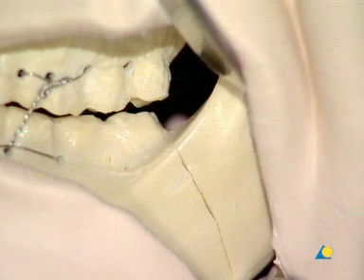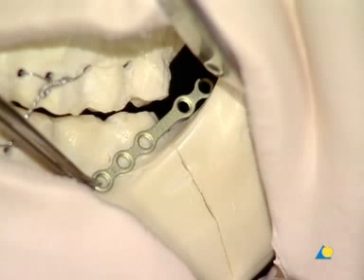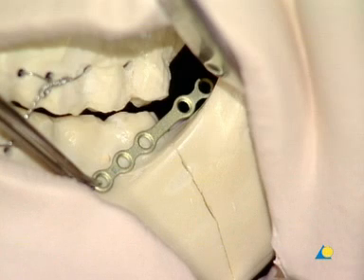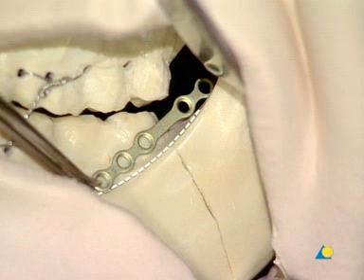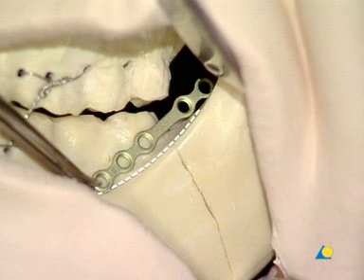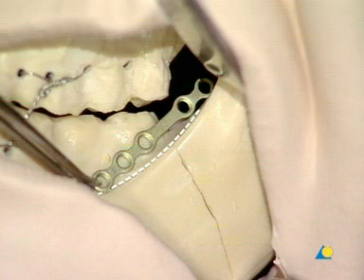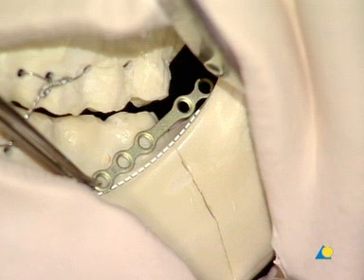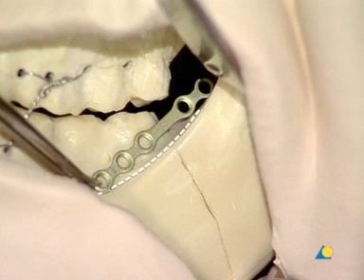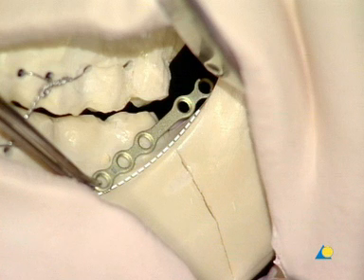A six-hole 2.0 mandible locking plate with center space is placed on the oblique ridge of the mandible, along the ideal line of osteosynthesis as described by Champy. The plate must allow for at least two screws in each main fragment and sufficient distance between the fracture line and the closest screw hole.